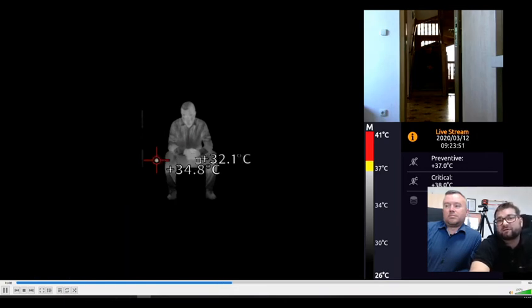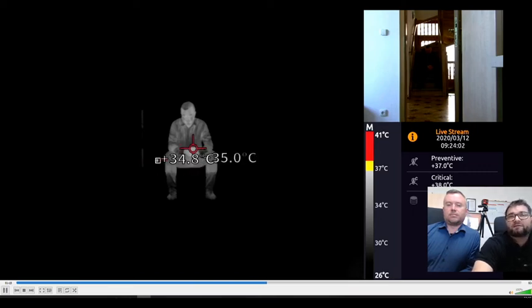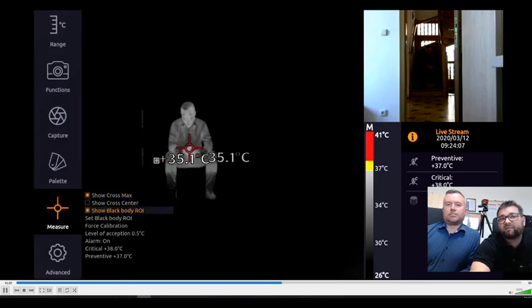In this section, you can see how it works. In case of the black body error on the right side, when you move with the cross off the black body, so in case you are not calibrated on the black body, you will get this error message, black body error. Now with the arrows, you can easily set the black body source again and calibrate.